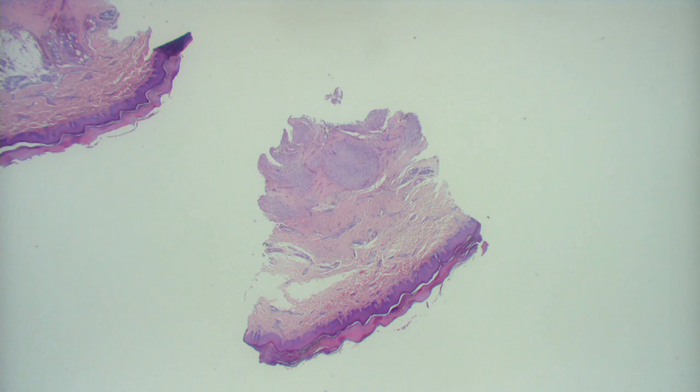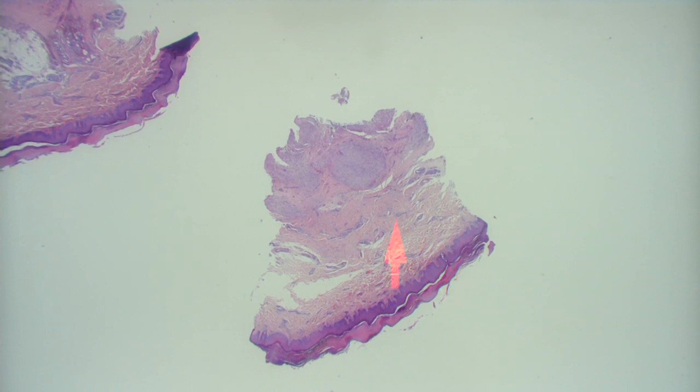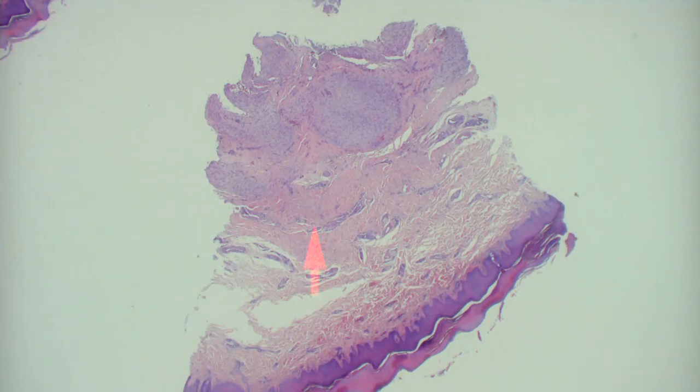Okay. So we have a punch biopsy. It looks like most of the action's in the dermis. There's a neoplasm in the deeper dermis, but superficial to that, it looks like there's a little bit of perivascular infiltrate. Good, we're looking at the process in the deep dermis. Excellent.